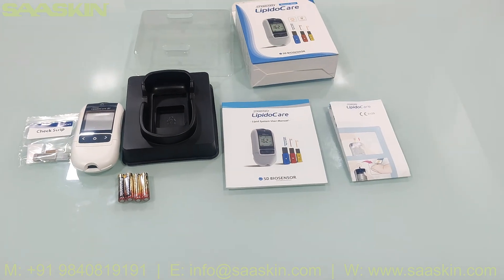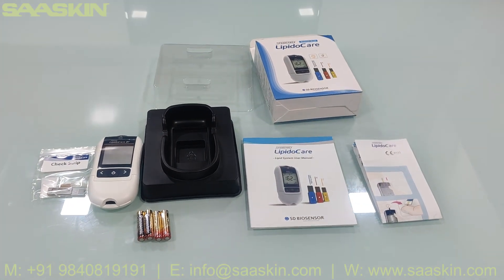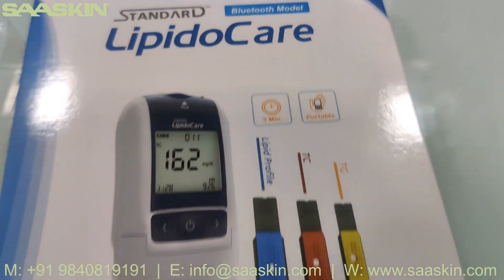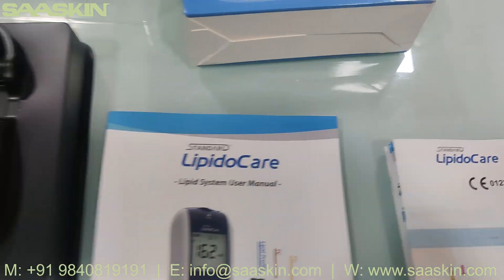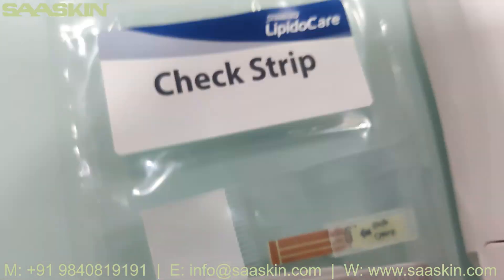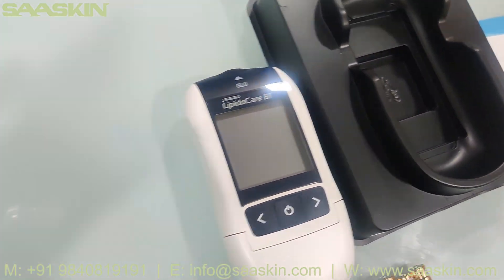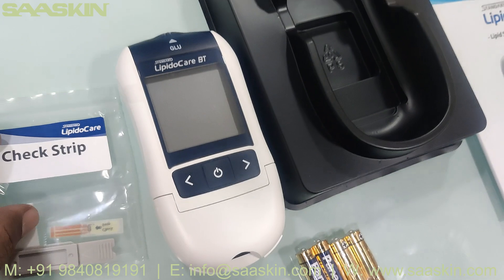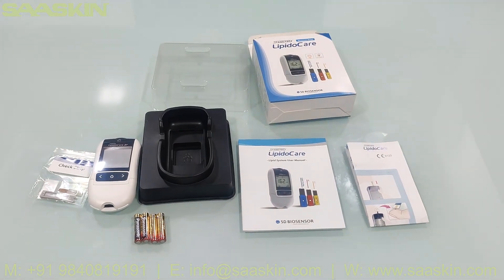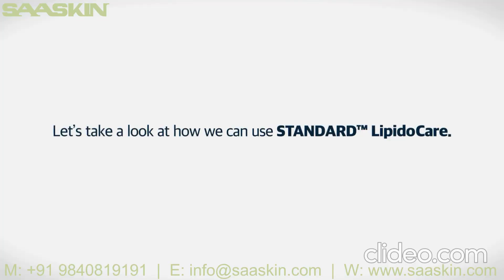This is what the total product kit looks like. Now let's take a look at how we can use the Standard LipidoCare.